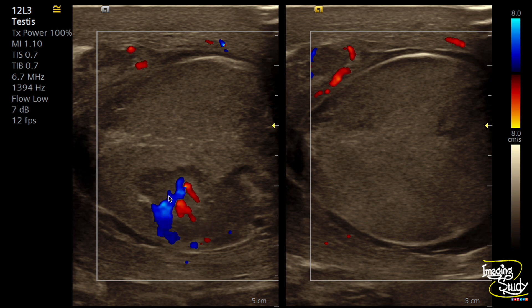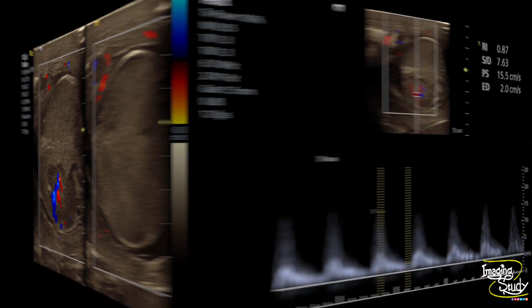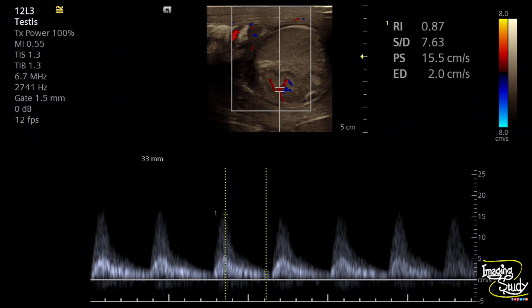On pulsed Doppler, these areas are getting supply from deferential or cremasteric arteries, which can be understood by the poor diastolic component. We checked a sample from the vascular flow of the necrosed area and you can see a high-resistance flow trying to supply this area. The resistive index is more than 0.75 — specifically 0.87 — which is a common flow pattern in testicular torsion. This is the flow coming from collaterals to this inflammatory area.